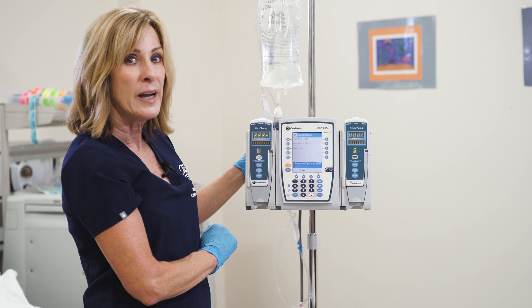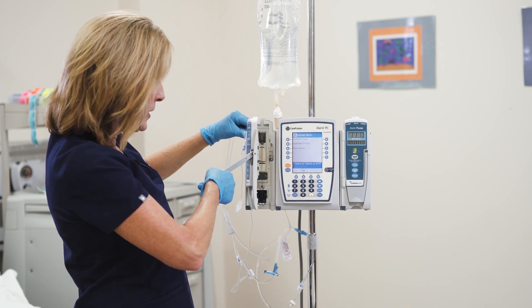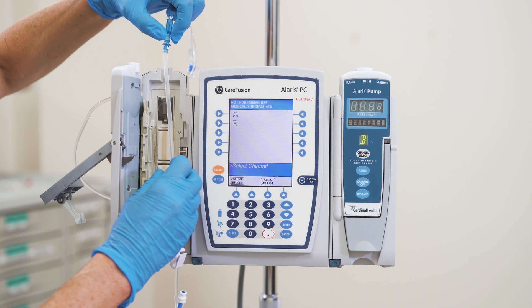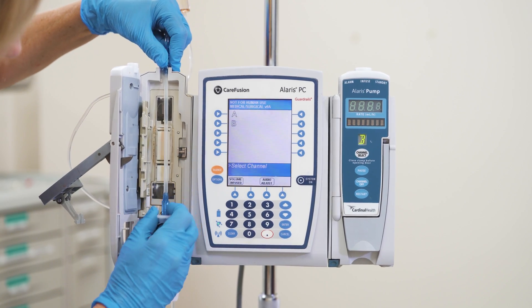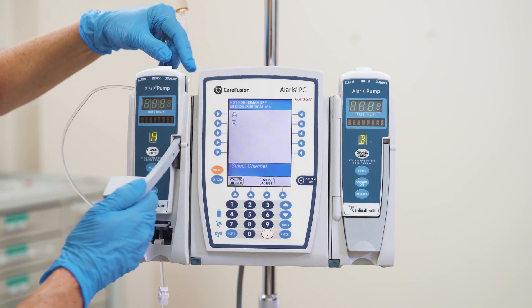We're going to go ahead and put the IV tubing into the pump. We're opening the door and taking our tubing — with the little edge at the top and the blue filter below — and pushing it in. It's going to click. Once it's clicked in, we're going to close the door gently.